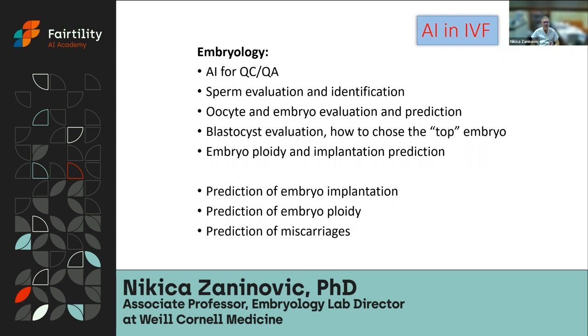Also to use AI to get non-invasive prediction of embryo ploidy as well as implantation. So there are different things that we can try to achieve. We can predict implantation or even maybe live birth, predict ploidy, even predict miscarriages.